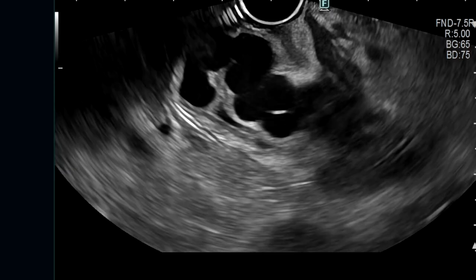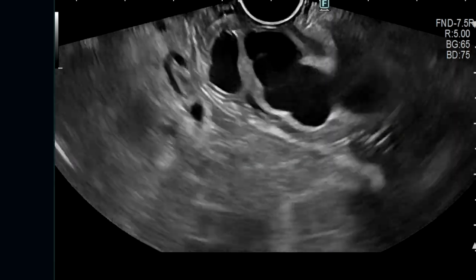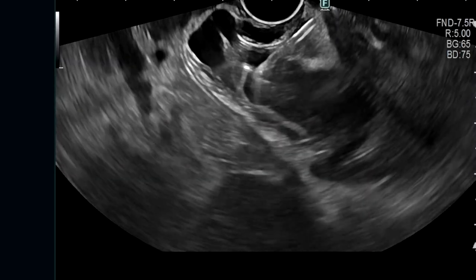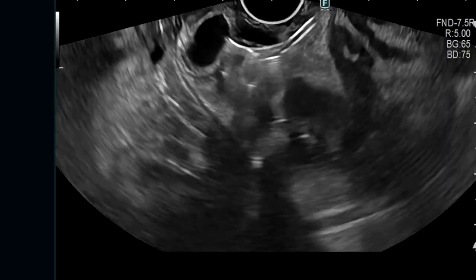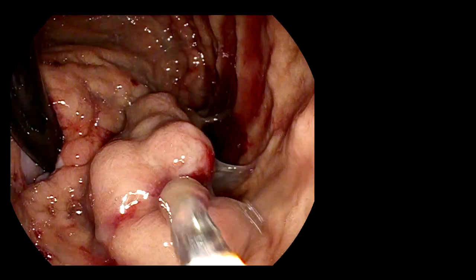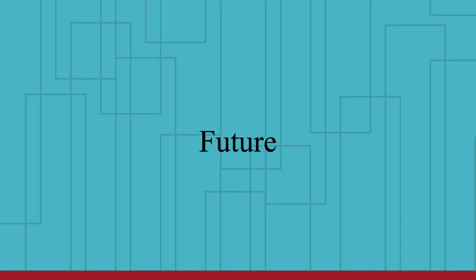As the presence of vascular flow was observed in an adjoining vessel, additional treatment was undertaken. On follow-up, the gastric varices had obliterated sufficiently, as observed. Given these promising preliminary observations, neovascular applications may be possible in the near future.